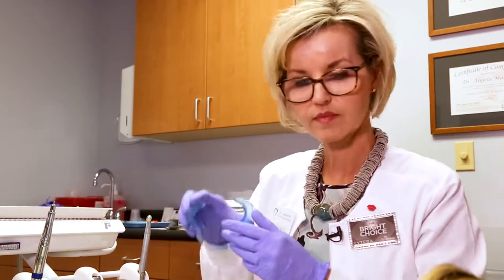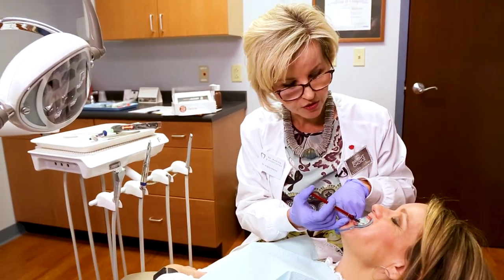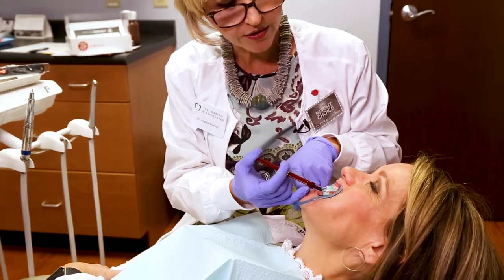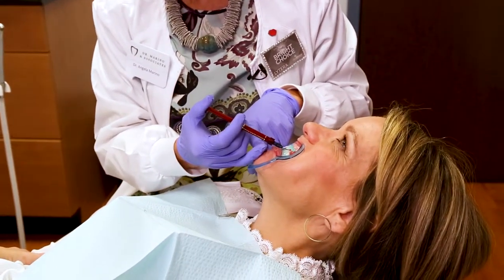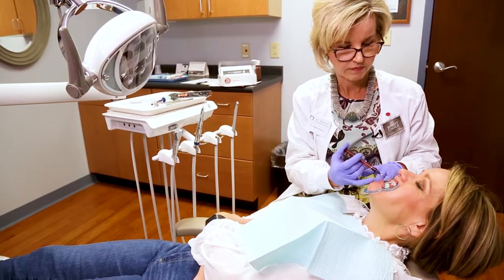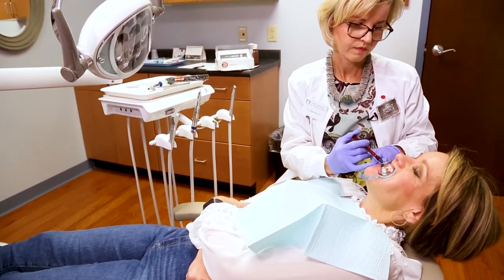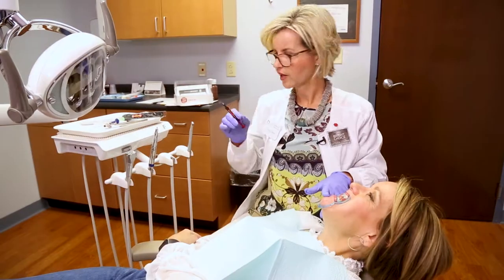The first thing I'm going to do is place some retractors in your mouth. Now that we've put the dam in, your gums are nice and protected. Now I'm just going to put the bleaching gel on, and this is the part that needs to sit for 30 minutes. If anything's uncomfortable let me know, but it shouldn't be. Excellent.